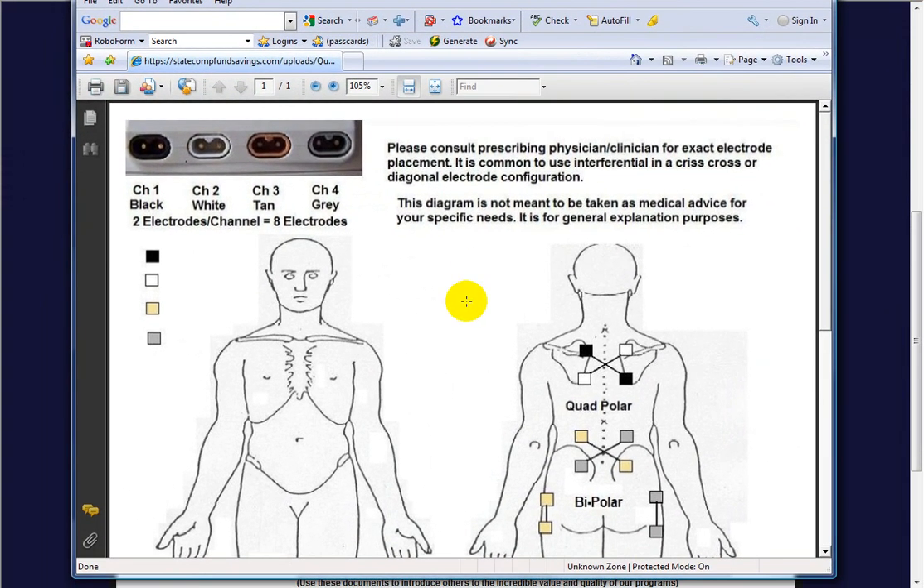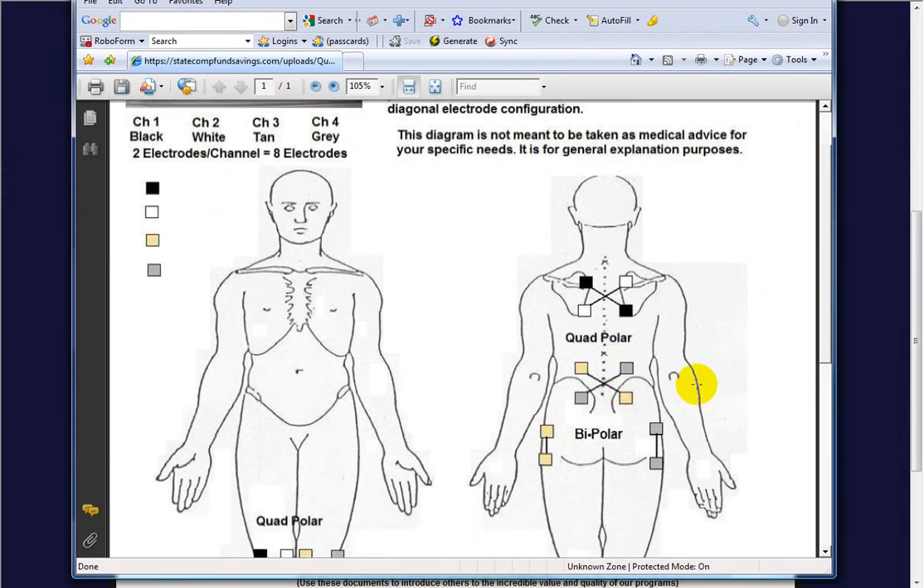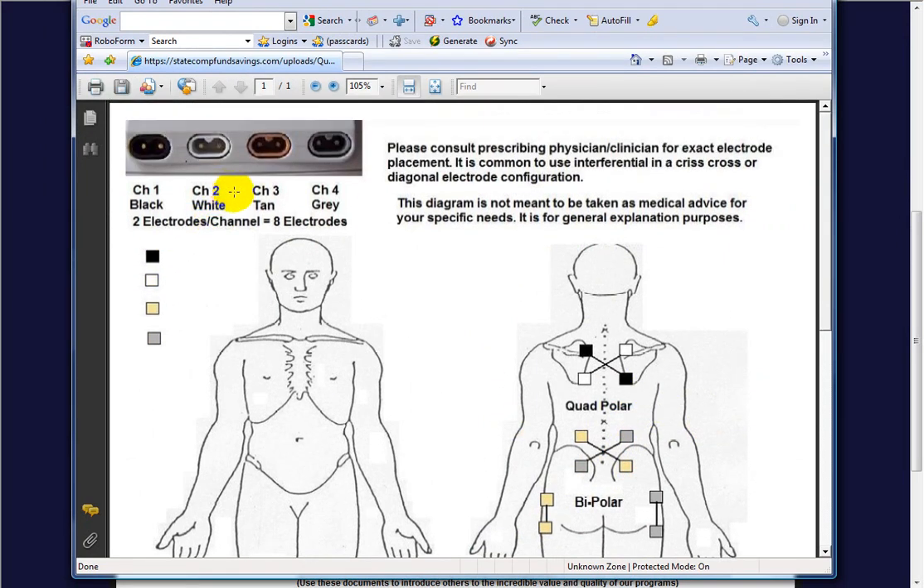I have another document on the electrode placement for the QuadStar 2. The QuadStar 2 is a 4-channel device, but you can use it as a 2-channel or a 4-channel. Let's say channels 1 and 2 are going to work together for Interferential. Channel 1 is the black wire — if you had upper back pain, you'd have one electrode here, and on the same black wire the other electrode would be here, like a line of an X.